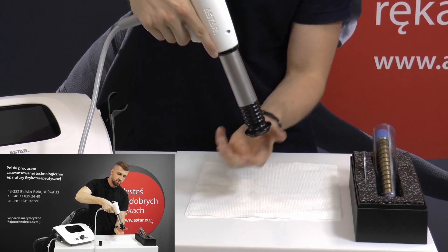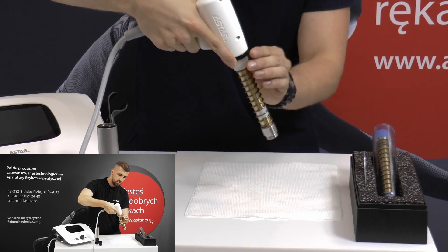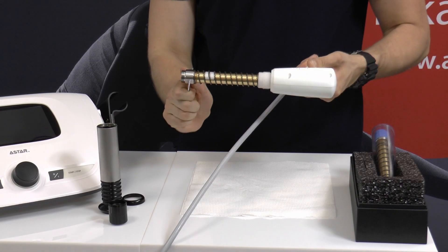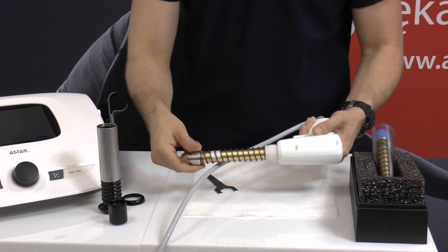Unscrew the mounted transmitter and the tube of the applicator, then take off the clamping ring. Using the wrench 22 attached to the kit, unscrew the projectile system and remove it from the socket.